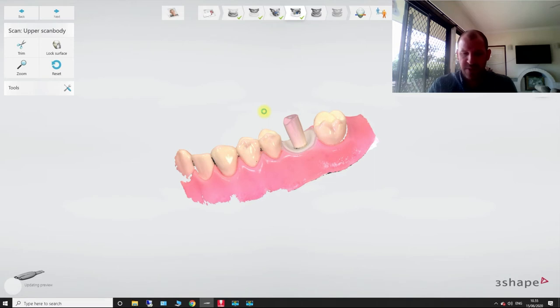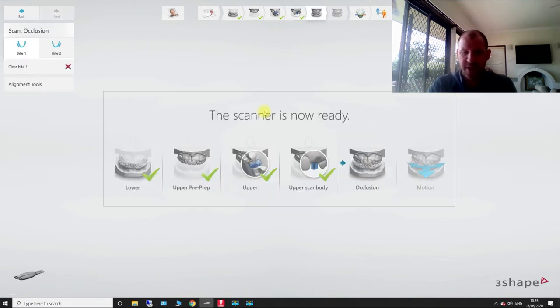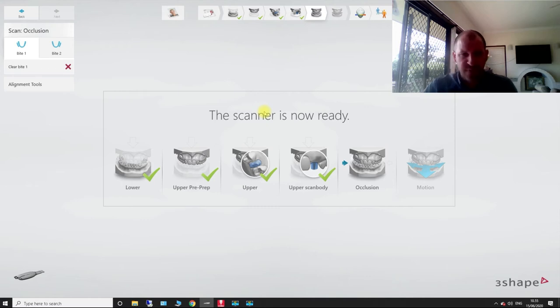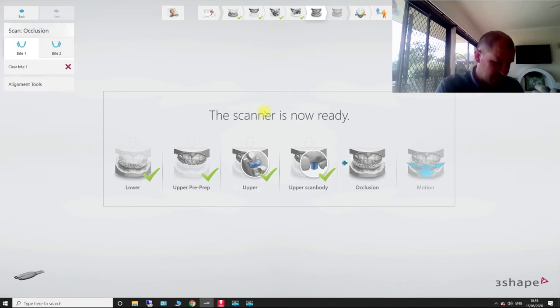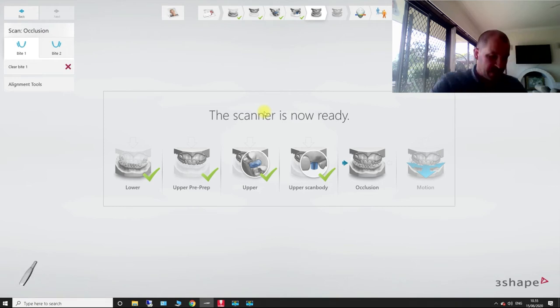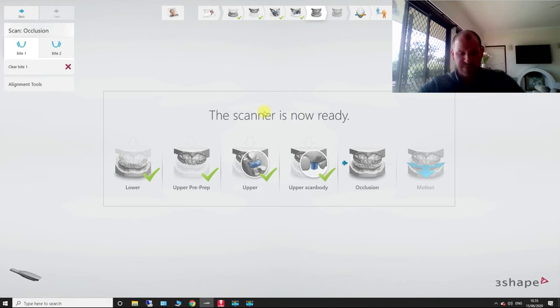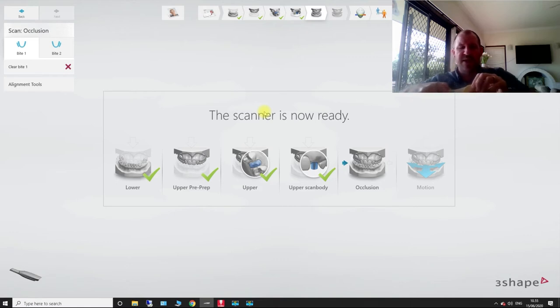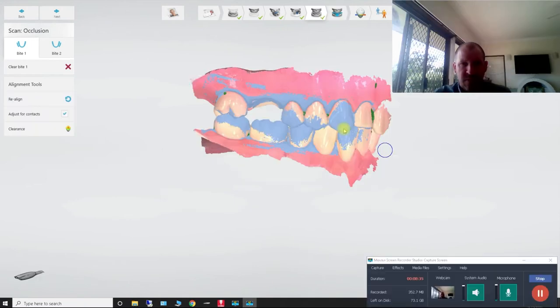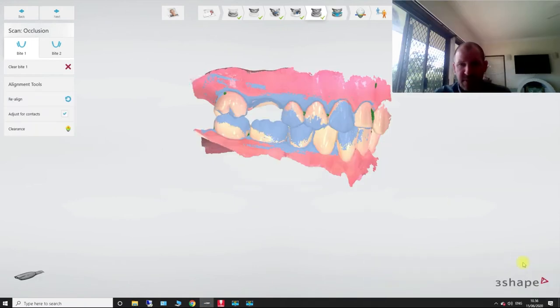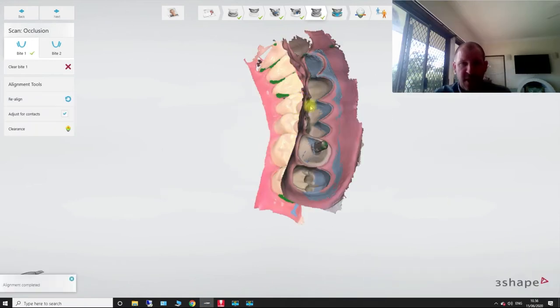So now we hit next, pull your scan body out, and now we're going to do the bite. Now, it's important when we do the bite that you make sure the patient bites down firmly. So let's just do this now. I'm going to push down pretty hard at the back because this model's a bit out of whack. So this is me asking the patient to bite down firmly. So that's our bite done.